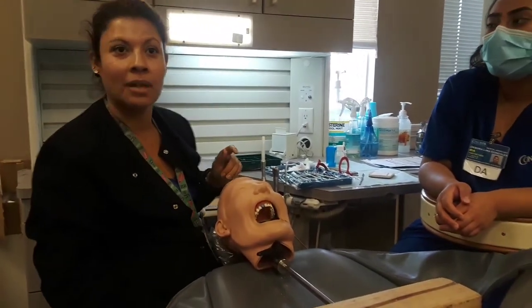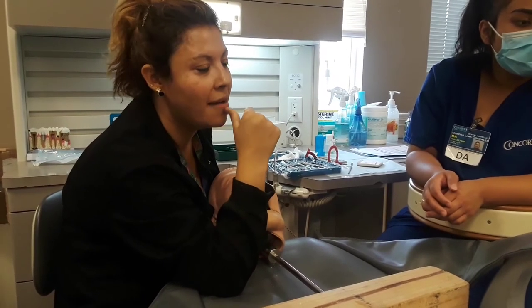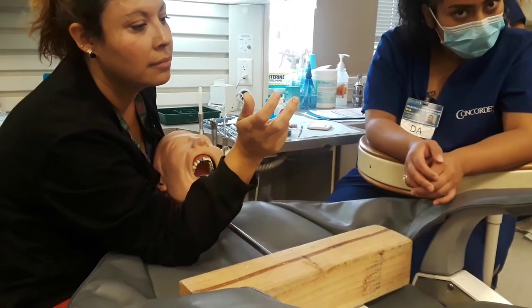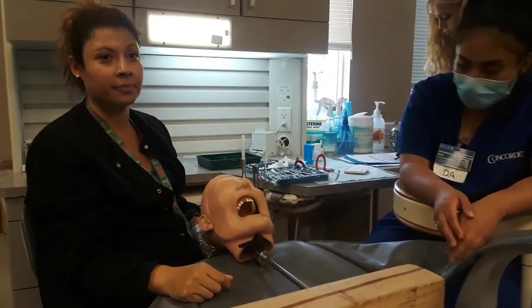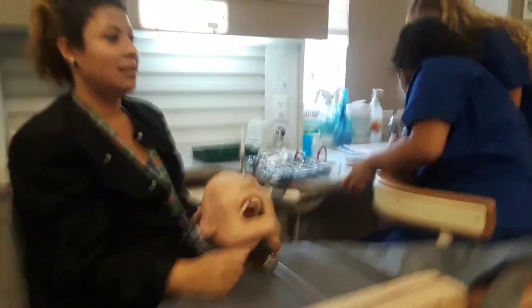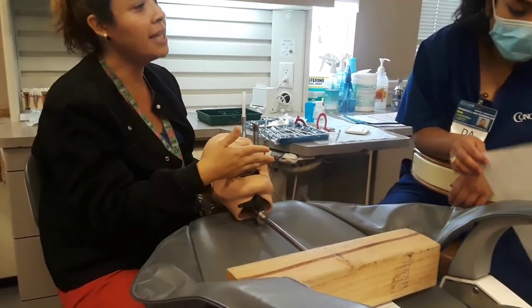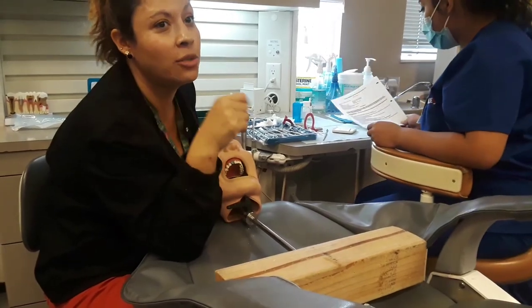When the patient flosses tonight, pull it through the facial — because again, they could dislodge the crown. 24 hours only — so tomorrow you can eat whatever you want and floss however you want. After the bite check, step 11, add a side note — that's where you take an x-ray. Right after step 10, before you pass the spoon. If you miss the x-ray at that point, please take the x-ray at the end — that's the check-off at least. Every doctor will verify it's at the margins, and that's where you check.